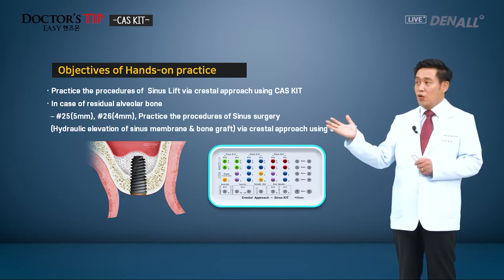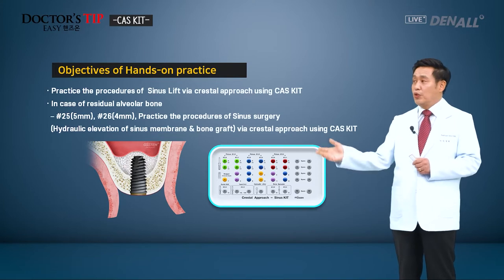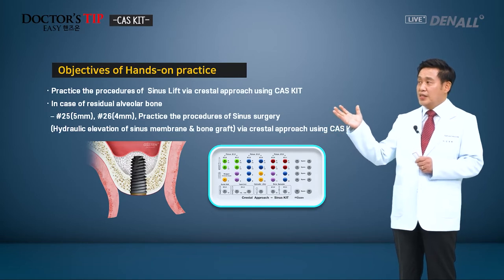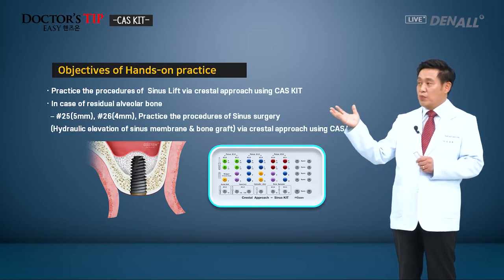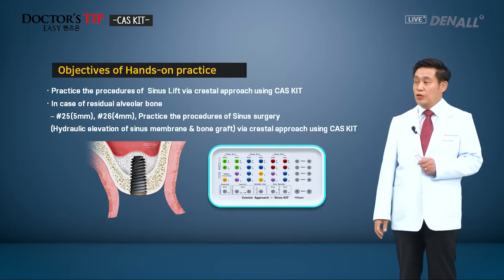Through the crestal approach, sinus lift will be made, and bone materials will be inserted to place an implant. Using the CAS kit, the sinus floor will be penetrated. The main function of the CAS kit is that the hydraulic membrane elevation will be done safely, followed by bone grafting and implant placement in this hands-on.